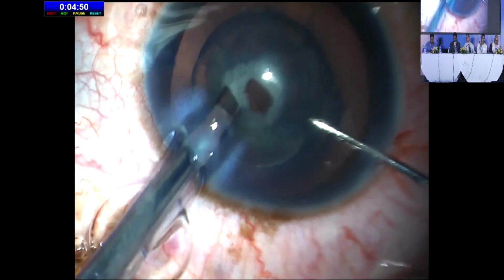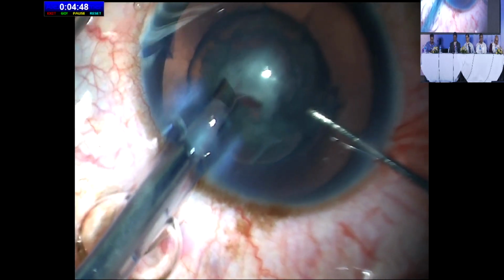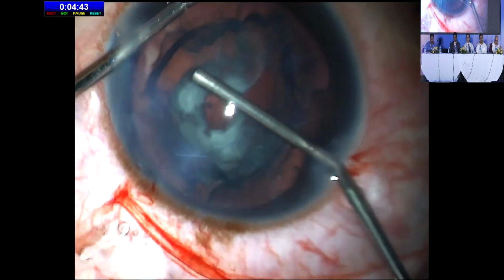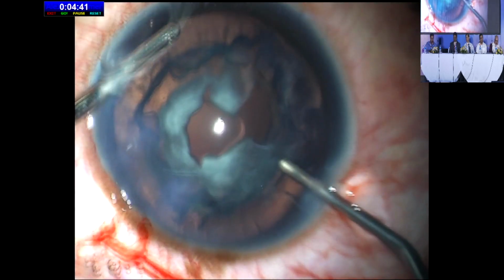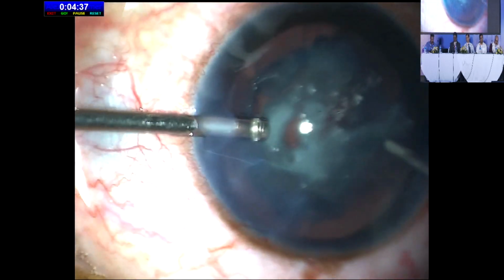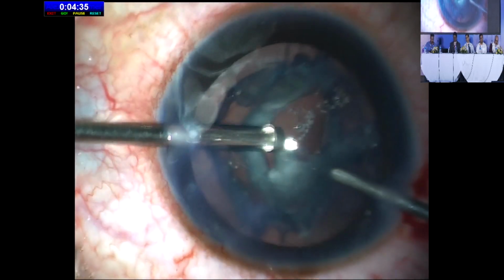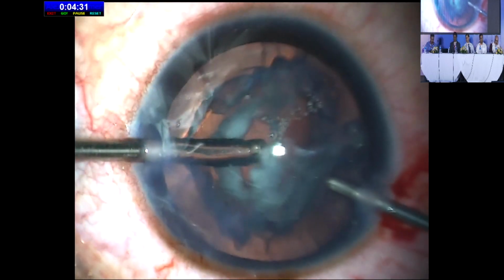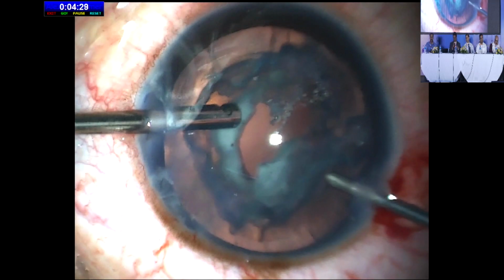In this scenario, you've got an entire soft nucleus in the eye and a posterior capsular rupture. So how do we go from here? A viscofluid exchange is performed, and then we do a trypan-assisted anterior vitrectomy. With the irrigation and the cutting dissociated, the 20-gauge cutter is now introduced into the anterior chamber, and you can see how it cuts the vitreous in the plane of the pupil in the area of the rent.